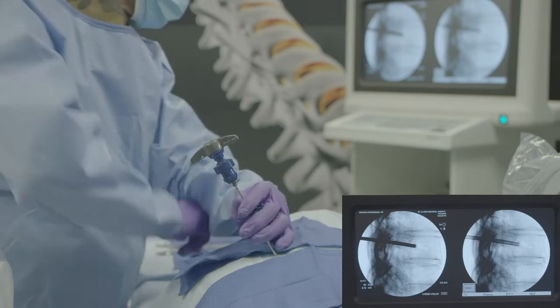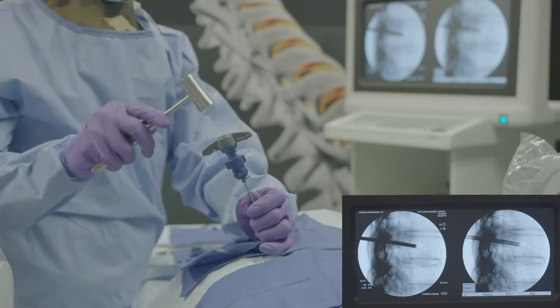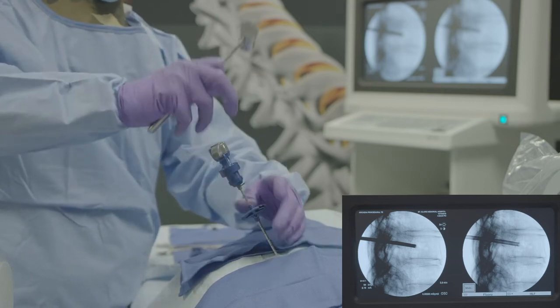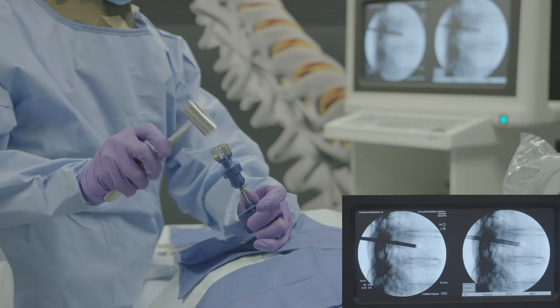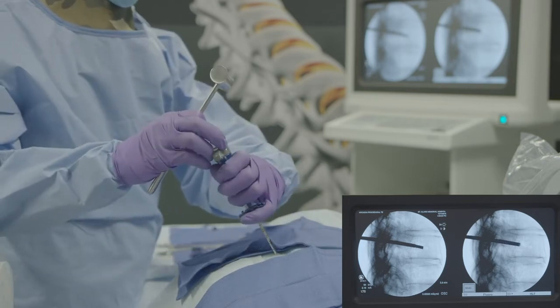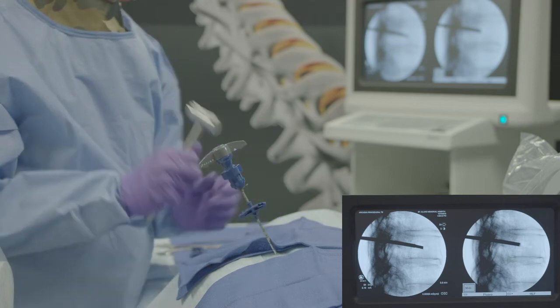In the lateral view, advance the power curve navigating osteotome to the next laser marking and rotate the deployment handle in a clockwise direction to articulate the tip. Alternate advancing and tip deployment with AP and lateral imaging.